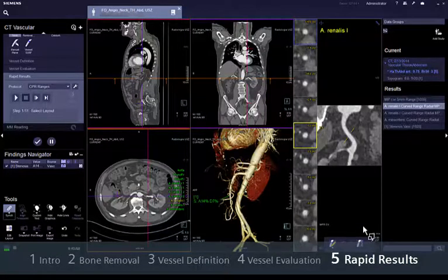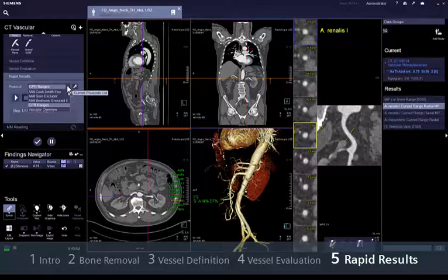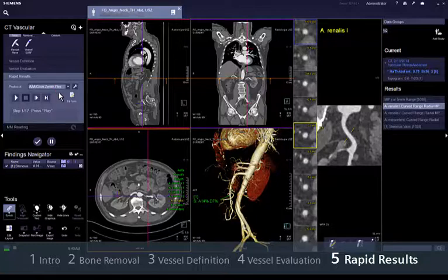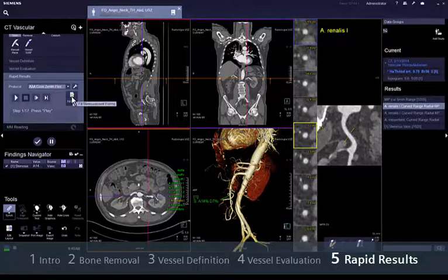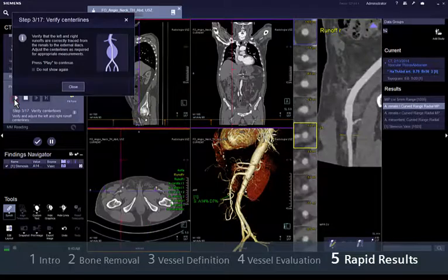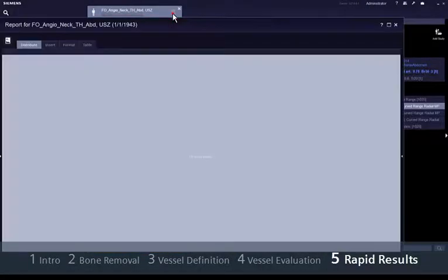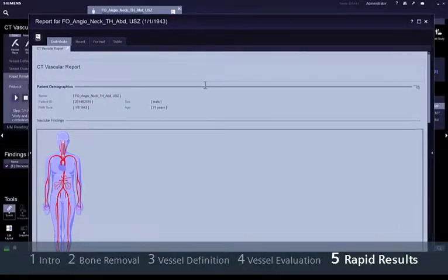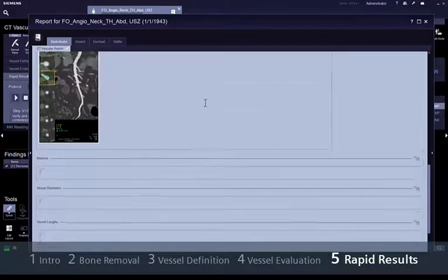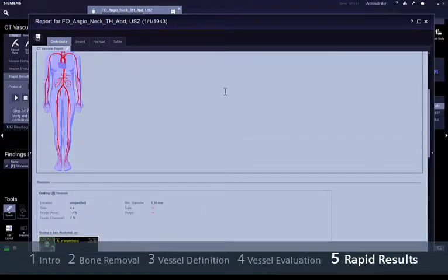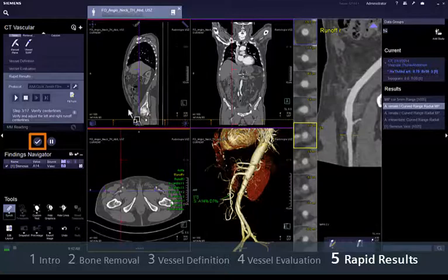For the treatment planning of abdominal and thoracic aortic aneurysms, Rapid Results offers a dedicated workflow called Rapid Stent Planning. This workflow guides you through an automatic completion of manufacturer-specific stent order forms. Just select the corresponding template, click on the Play button and follow the steps. You also have the option of adding individual customised templates. All results are conveniently collected in a report, and saving and archiving this report and the results series is as easy as clicking the Save and Send button.